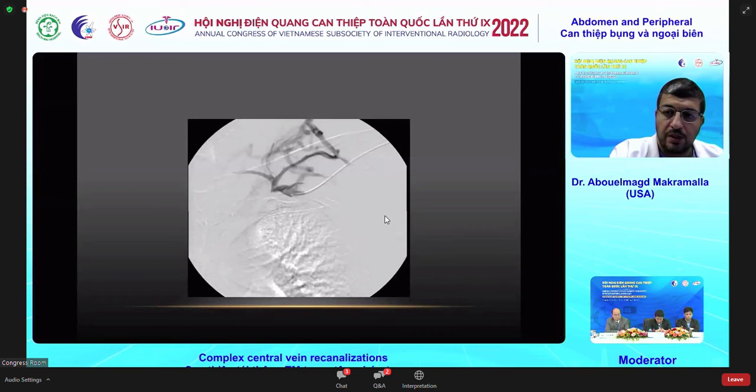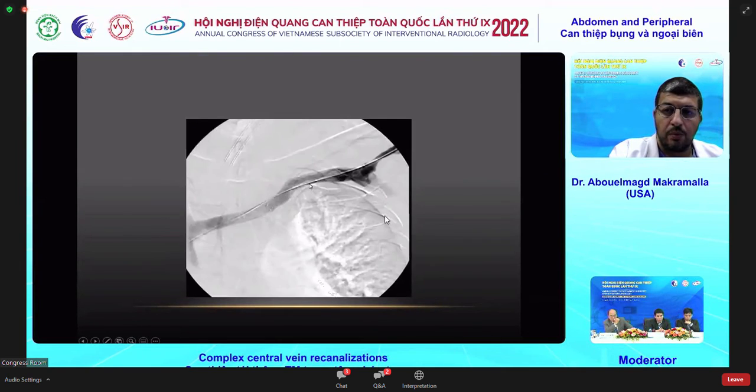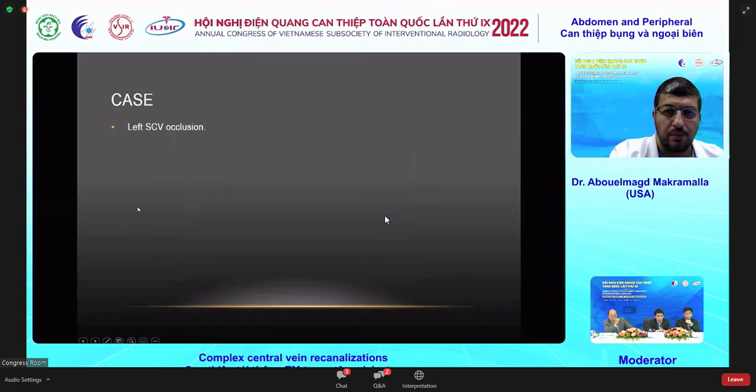So we actually placed a metal cannula from the TIPS set that we use to perform TIPS in the liver, and we obtained femoral access and placed a snare as a target and triangulated it, and then advanced a 22 gauge 55 centimeter Chiba needle through the metal cannula directed towards the snare. We were able to advance the wire, snare it through, and then place the covered stent, which maintained patency, and this helped resolve the swelling and the pain.